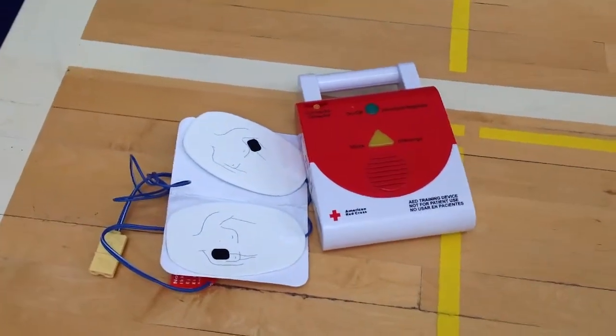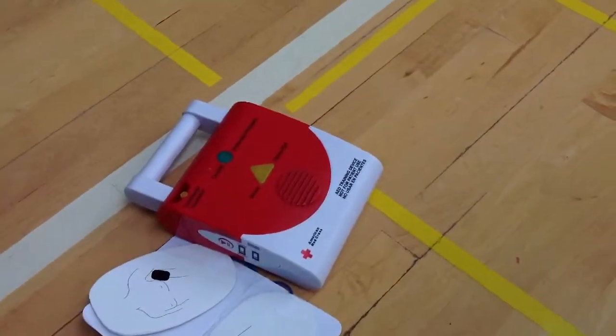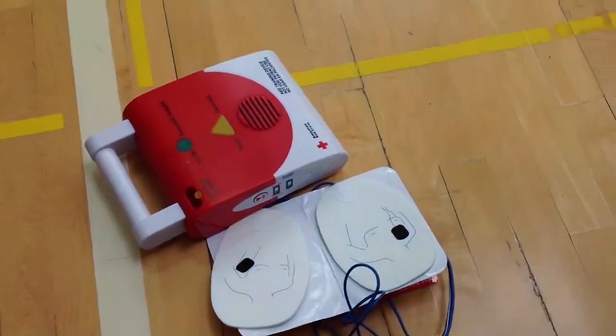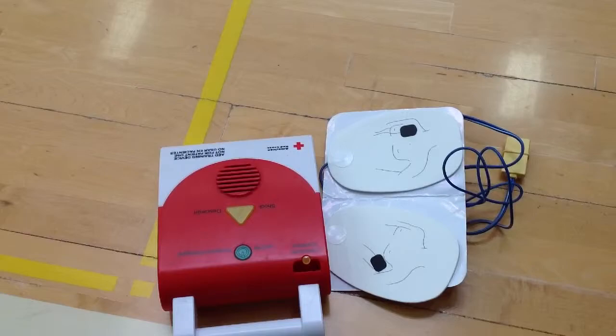An AED, or automatic external defibrillator, is a Red Cross device that is left in places like a school so that in a state of emergency, you can use one to possibly save someone's life. It's used to help someone who has heart trouble, and if you were to find them unconscious, you could use the AED to help save their life.